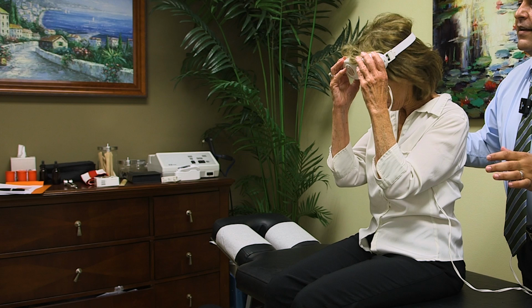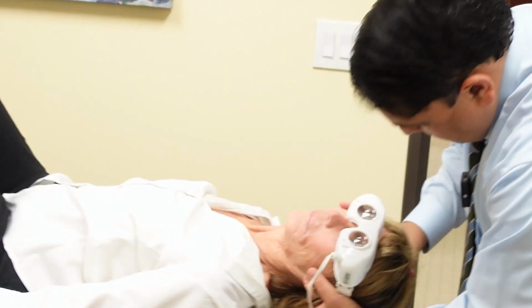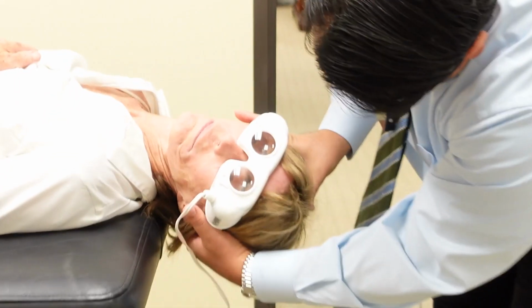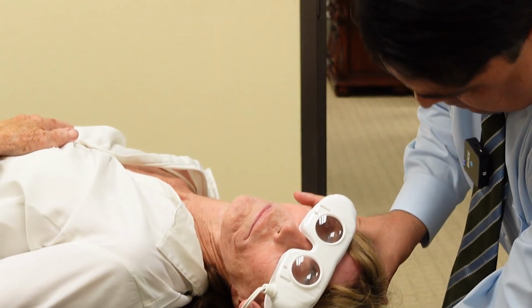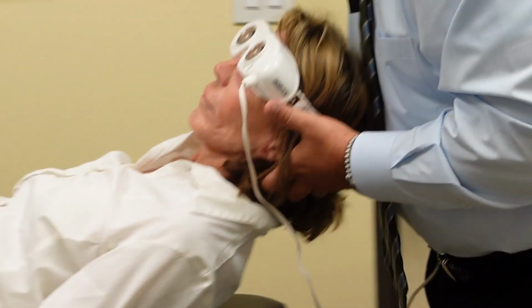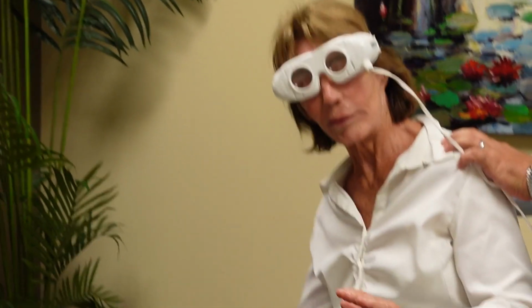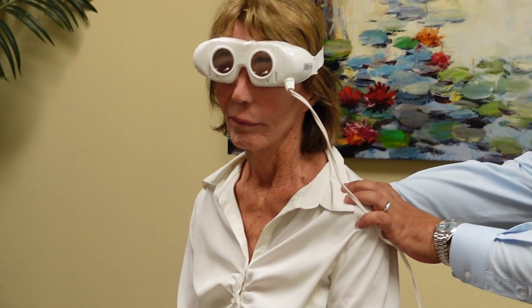So here we did the Dix-Hallpike maneuver, and you can see she's wearing these Frenzel goggles where she can't really fixate on a target outward, but I can see her eyes. With the Dix-Hallpike maneuver, you basically have the patient lie on the table, and then you want to make sure the person's head is rotated to one side and in extension. This is a test to see if a person is having benign paroxysmal positional vertigo, BPPV, which is the most common cause of people that have vertigo and dizziness.